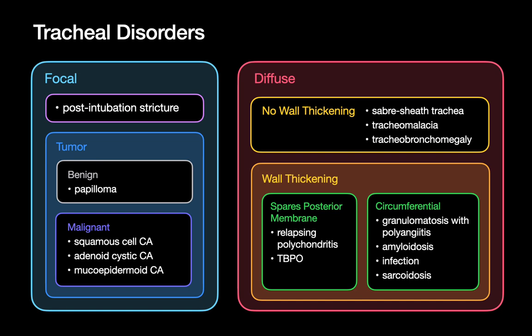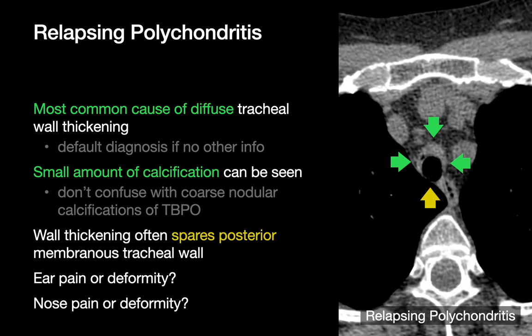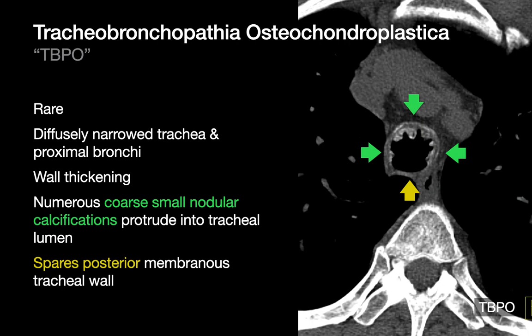Relapsing polychondritis is the most common cause of diffuse tracheal wall thickening. Some element of calcification can occur within the thickened areas. The hallmark is wall thickening of the entire trachea that spares the posterior wall, which remains normal in thickness and very thin. Relapsing polychondritis often manifests elsewhere as well, so these patients may have concurrent ear or nose involvement in addition to the tracheal disorder.